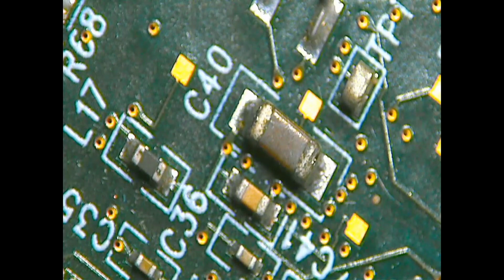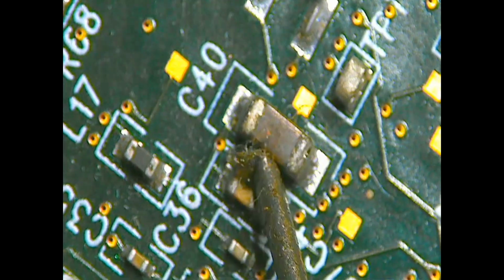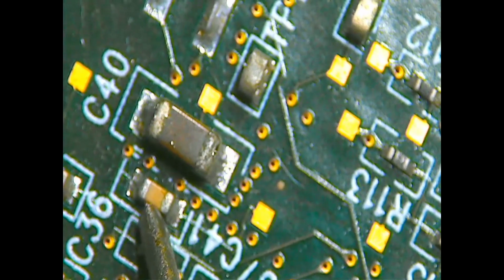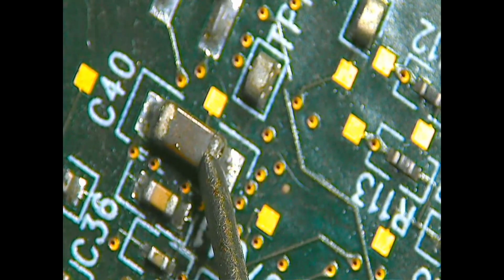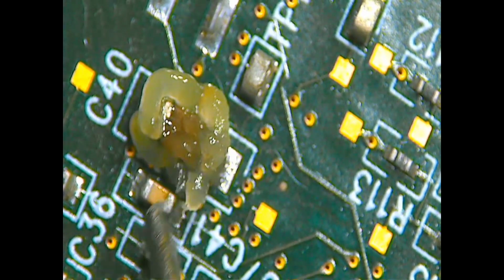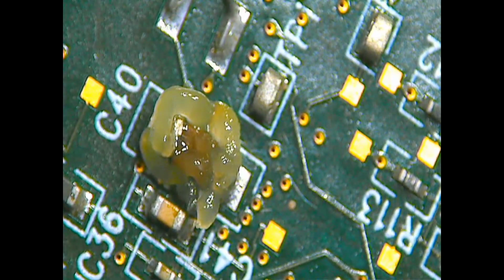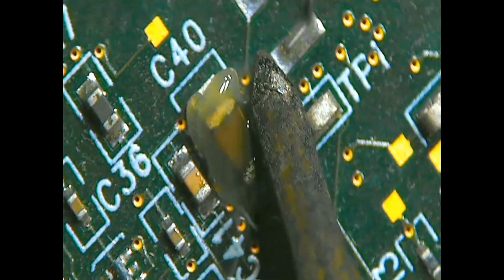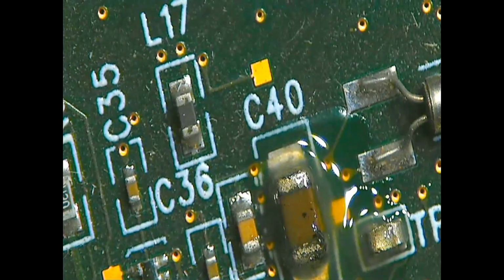So before that, I need to put some flux. Okay. Now everything is ready. Okay.